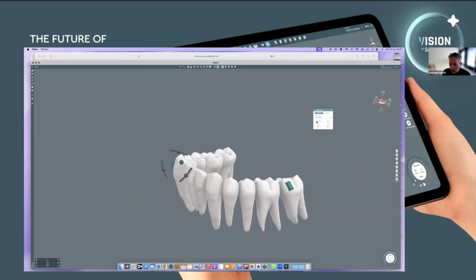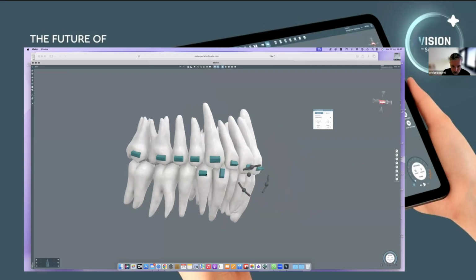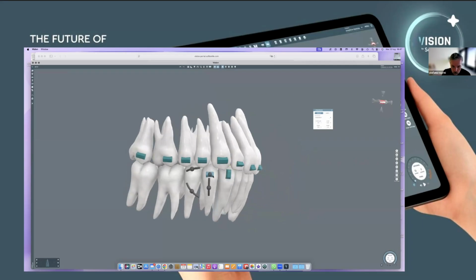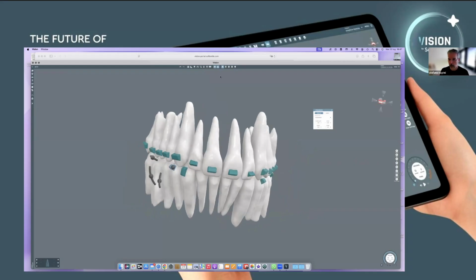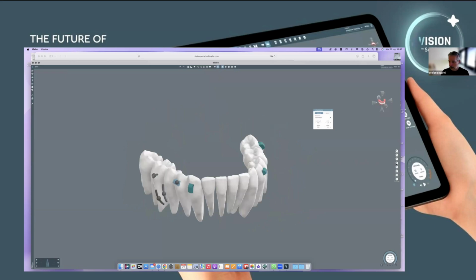Okay, put this one. Check a little bit up. Okay, the last is just this one.